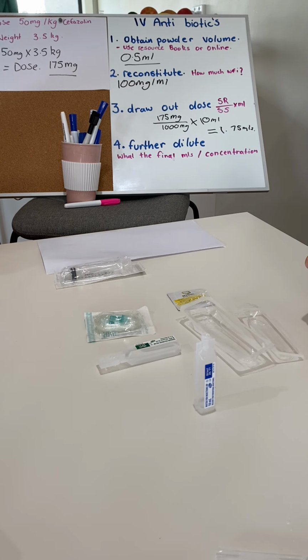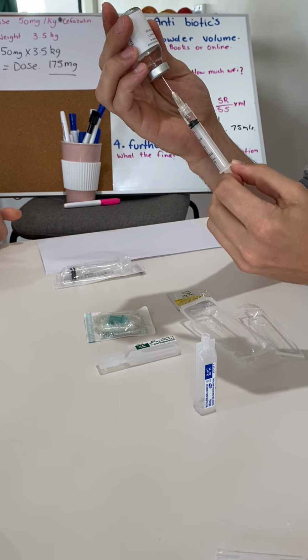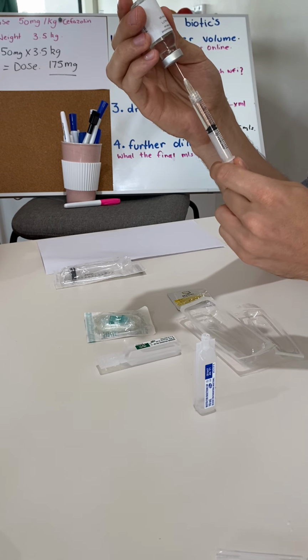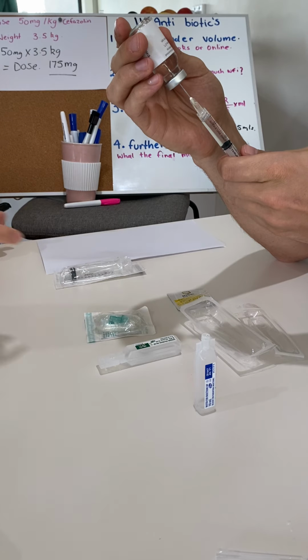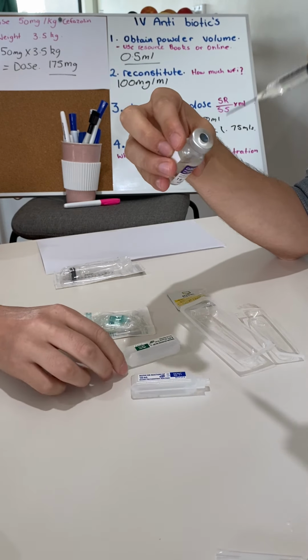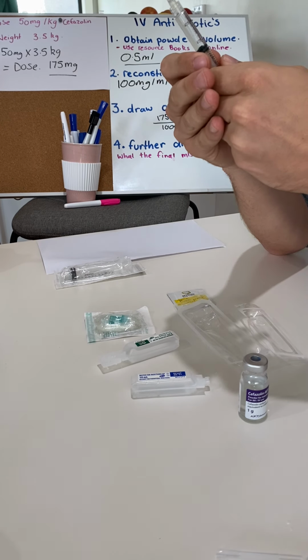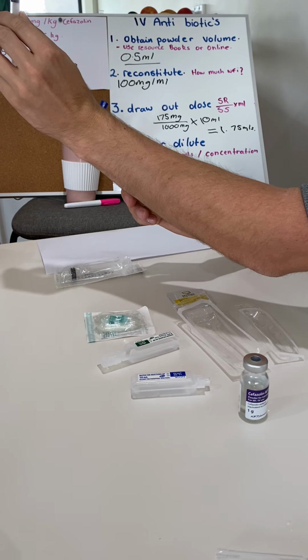Whilst doing this, it's also important that we continue our 5 rights of medication throughout. So making sure that we've got the right drug, we've checked our cefazolin, it's in date, we've got the right concentration. So ensuring that we follow these steps as we go. It's also important to notice the date on the water for injections and the saline that we use later as well. 1.75, great.